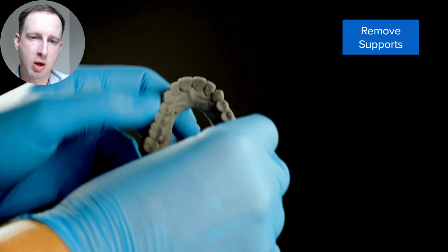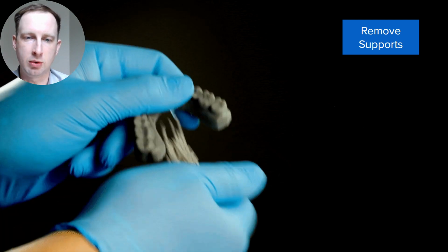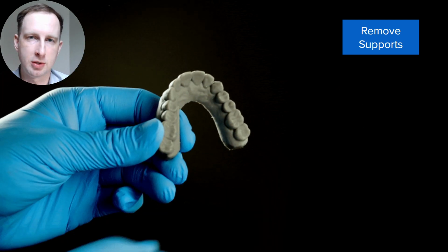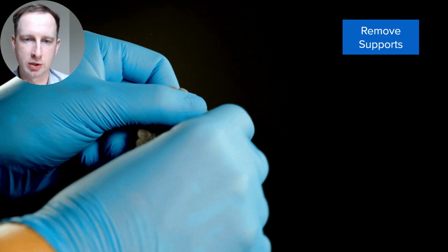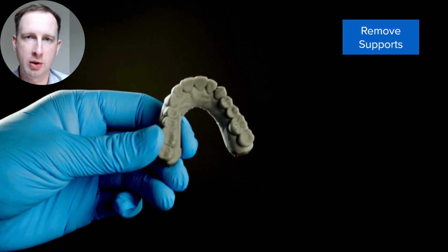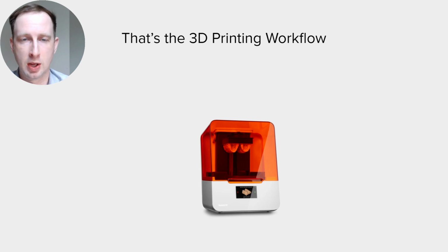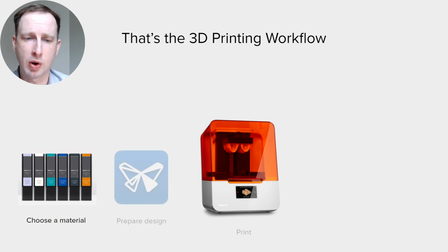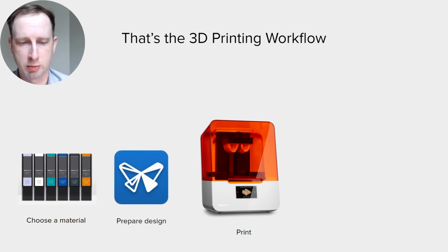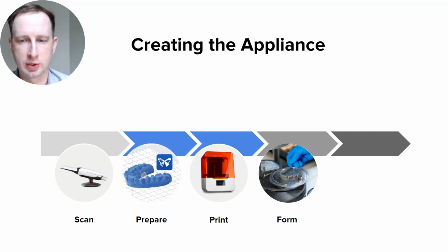If you do support your models like what's shown here, the Form 3B really does fantastic, very small touch support tips, easy to rip them off, does a good job of not creating divots, but actually leaving a little material behind, which is what you want when you thermoform. You do not want a divot because otherwise the plastic will be larger than the anatomy. And that's really the 3D printing workflow. Once you've printed, washed, and cured, you're ready to move along. So you have your material, you bring it into PreForm, you print, wash, and cure, you're ready to go.